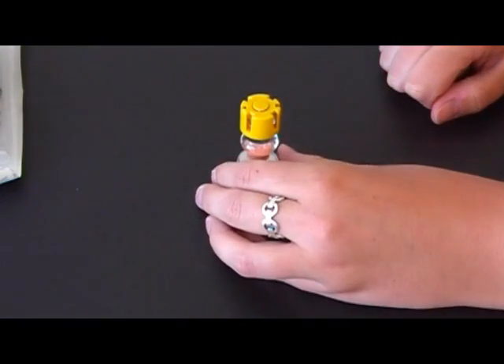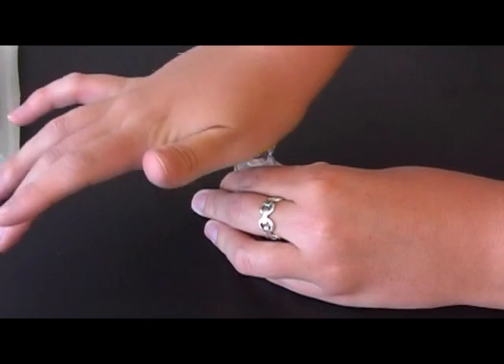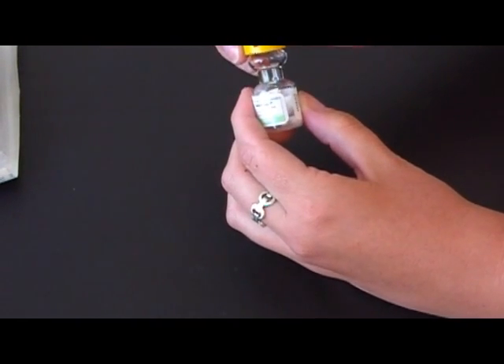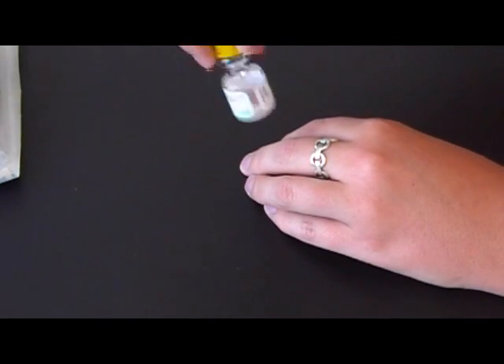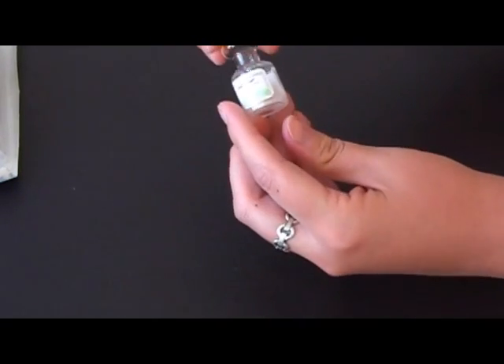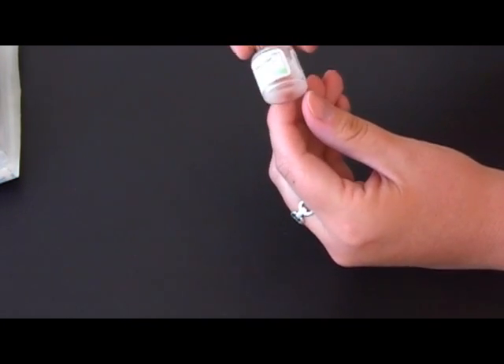The first step is to activate your Solu-Cortef vial. To activate the vial, place it on a firm flat surface and push down on the lid hard. You have to dislodge the orange stopper down into the bottom of the vial. Next, shake the vial to dissolve all the medication. The goal is to have no lumps and you want all the powder to be dissolved.